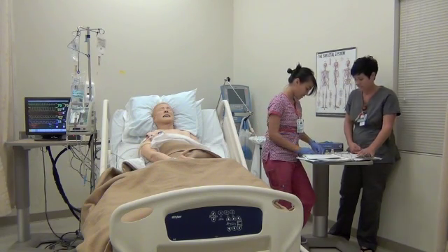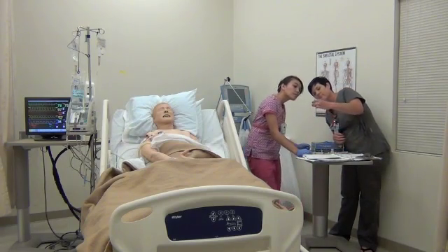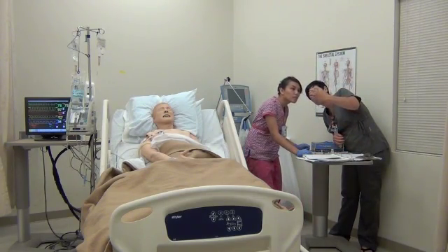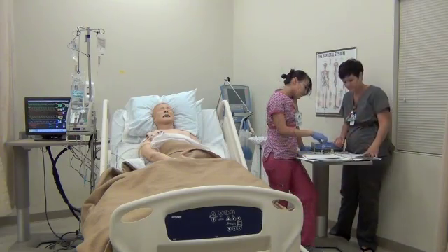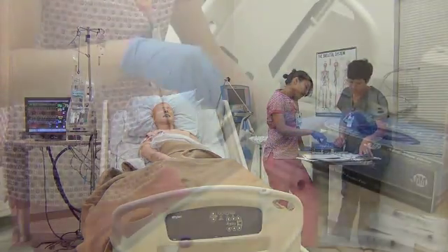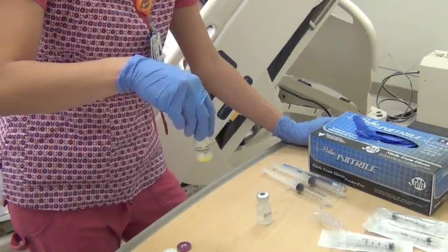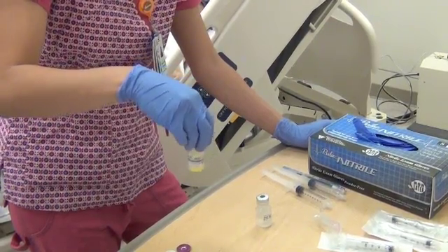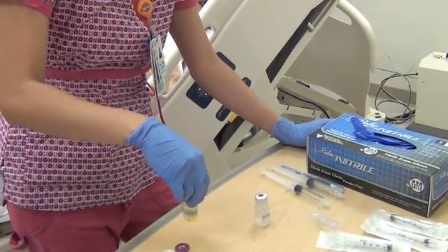Allow the vial to stand undisturbed to allow large bubbles to dissipate. Mix gently by swirling until the contents are completely dissolved. This should occur within 3 minutes. Do not shake the vial.